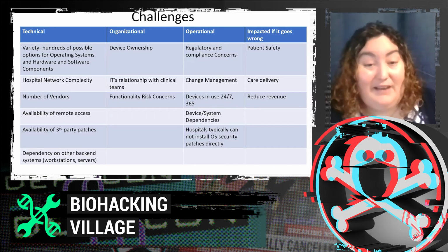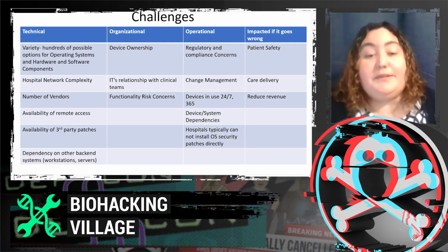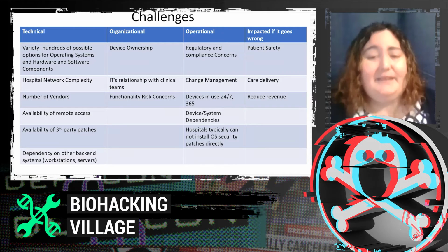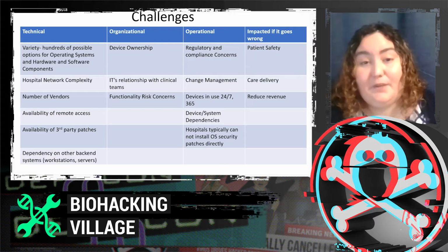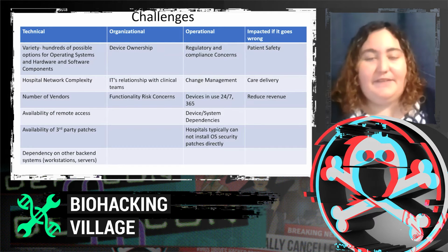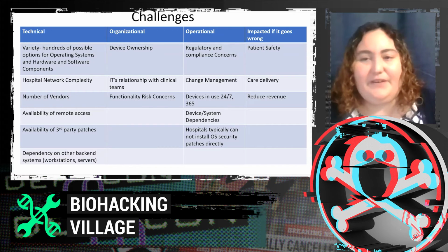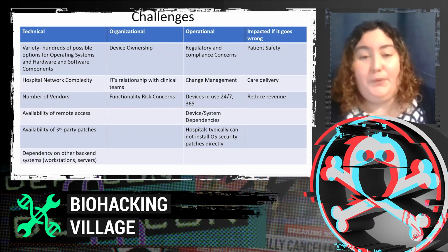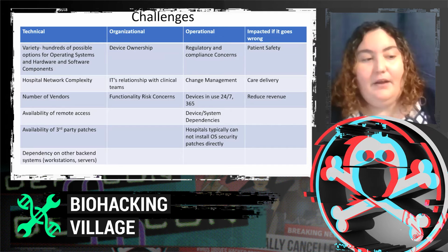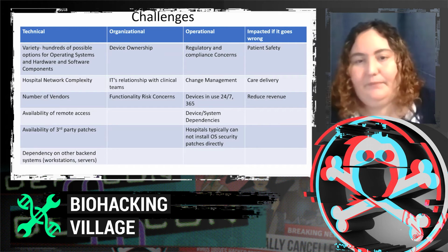Hospitals are typically not allowed to install operating system patches directly. This is becoming less of a problem as more software-only solutions are created, but it is still a problem, especially in your legacy devices and install base. And what is impacted if things go wrong? Patient safety, care delivery, and you have a reduced revenue. If you have to divert patients, if you have to delay diagnosis, you're going to have a reduced income.